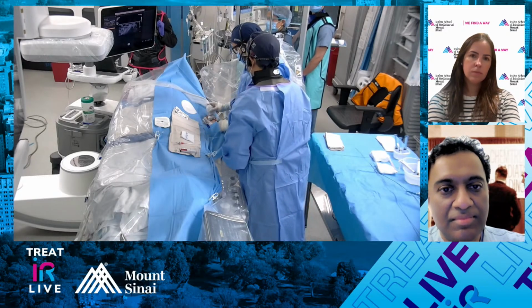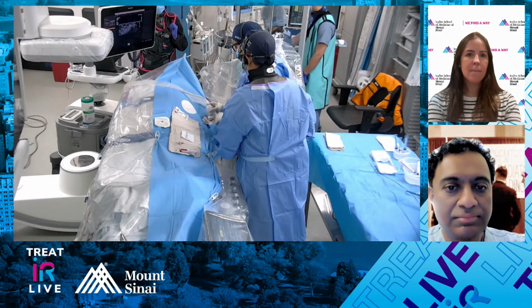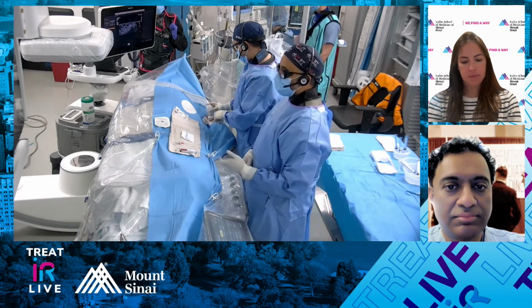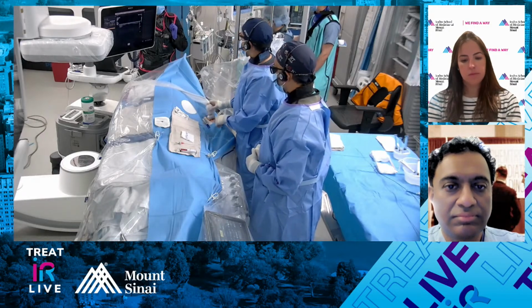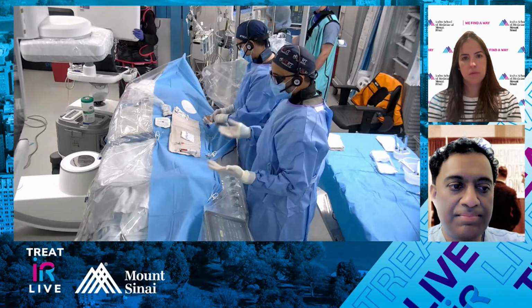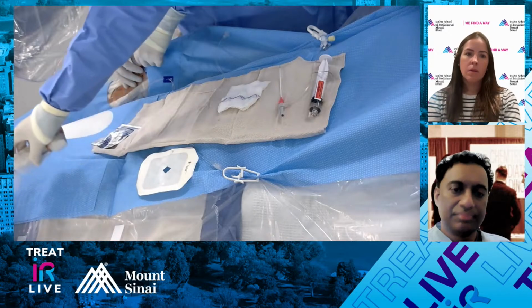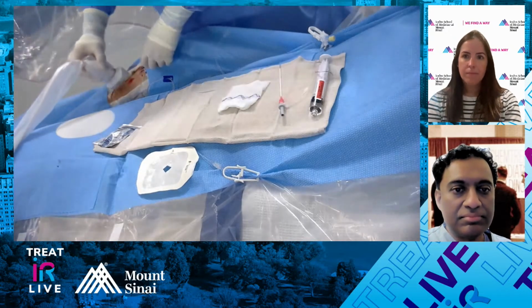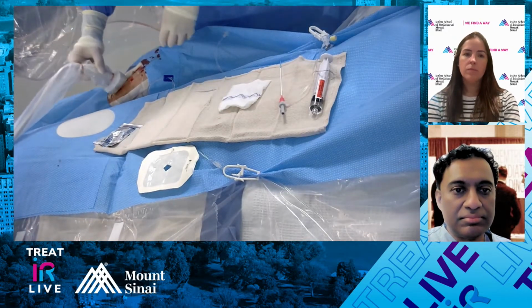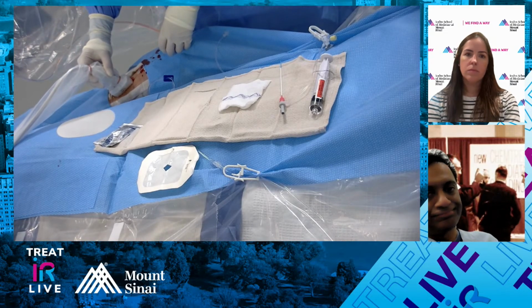Exactly. We did the angio before, and looked for another type of leak a year or two ago just to make sure, and he did okay. We didn't see any type 2 endoleaks, and so now this is what we're left with. His sac has now grown to 8 centimeters. So I think we have to bite the bullet and extend him.